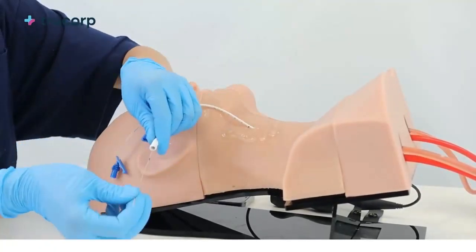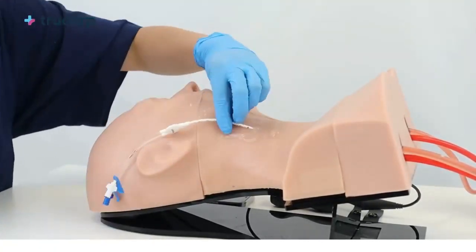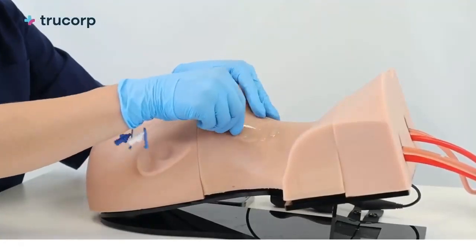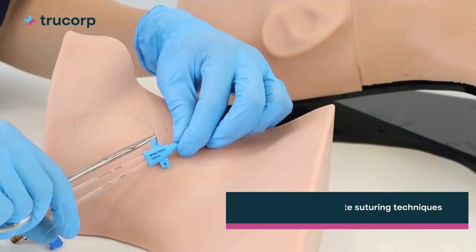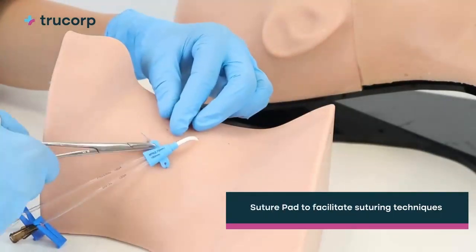TruCVC accurately represents the upper torso and neck, right clavicle, manubrium, first right rib, and sternocleidomastoid muscle, therefore providing detailed vascular anatomy including the internal jugular vein, subclavian vein, carotid artery, and subclavian artery.